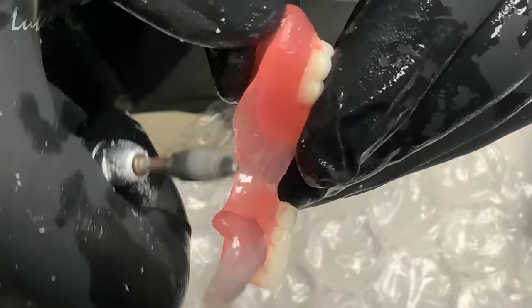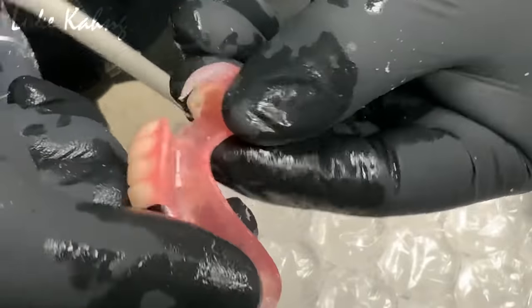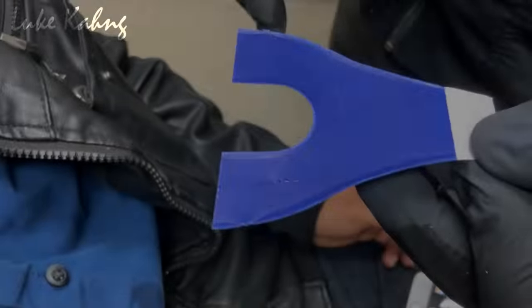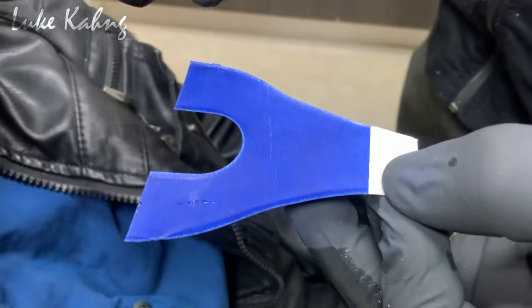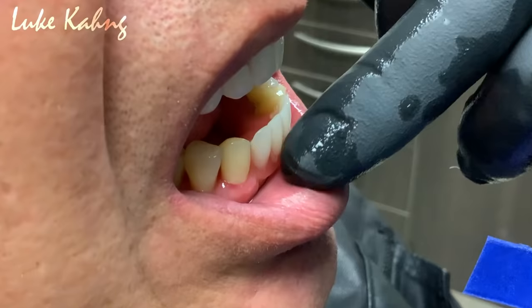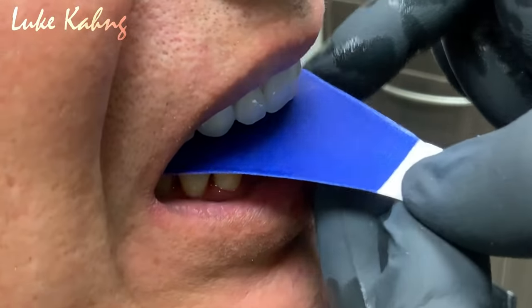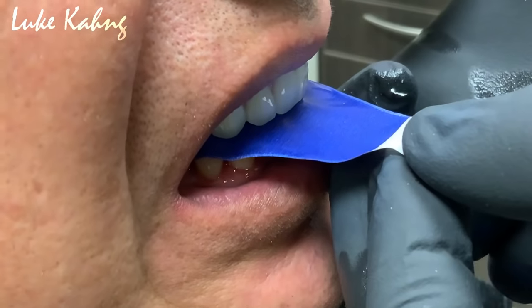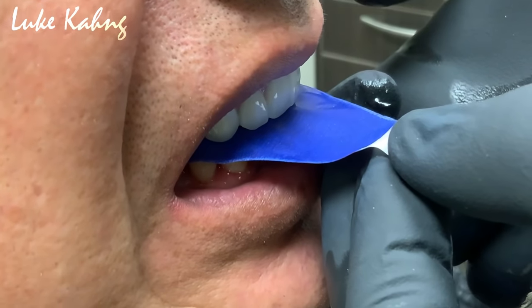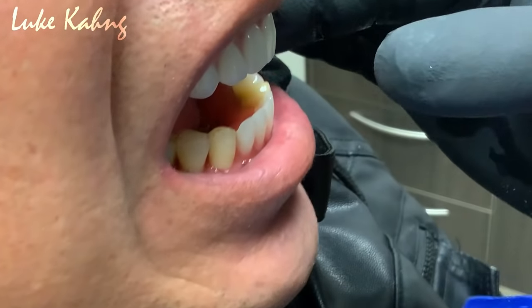There's a little area right here, like that. You just do it towards you. And then it just peels right off, see? Got it? We're at a very close state now, where the bottom has been adjusted nicely. You can see that? That's his flexi. So now I ask the patient, okay, go ahead, close. Tap, tap, tap. There we go. Open.